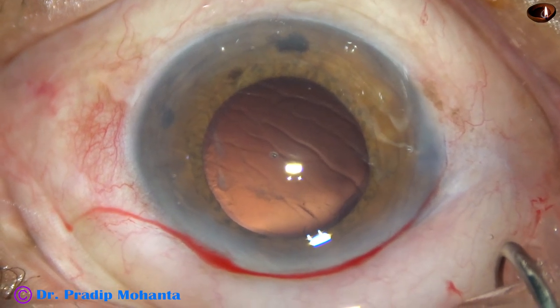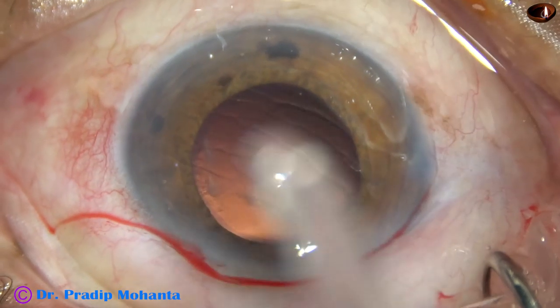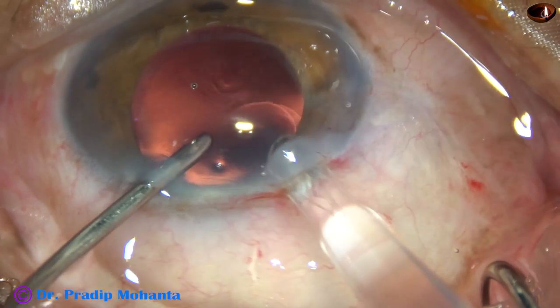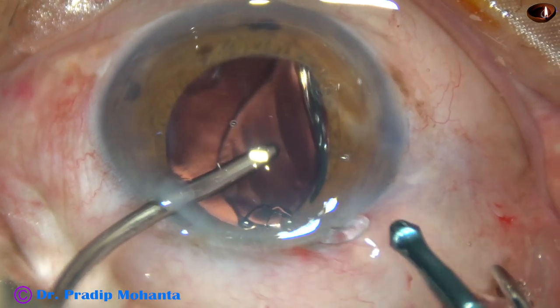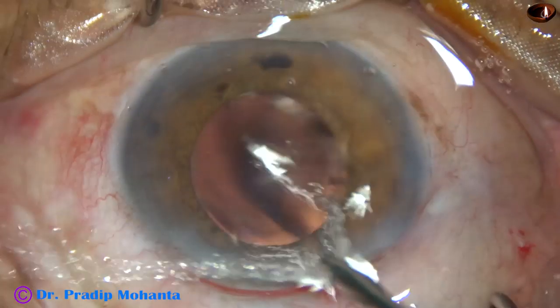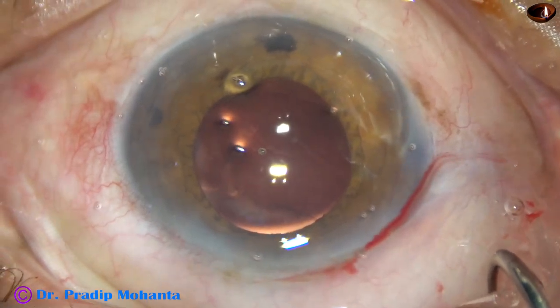It is time to implant an intraocular lens — this is what is called hydro implantation. The anterior chamber is kept formed by hydro, that is BSS. The intraocular lens goes into the capsular bag. The leading haptic goes into the capsular bag, and the trailing haptic, just by a push of the left hand instrument, goes into the capsular bag. Then it is dialed by the same instrument.